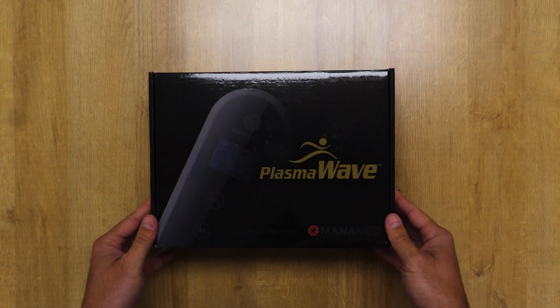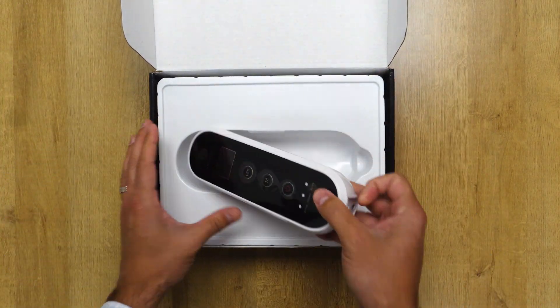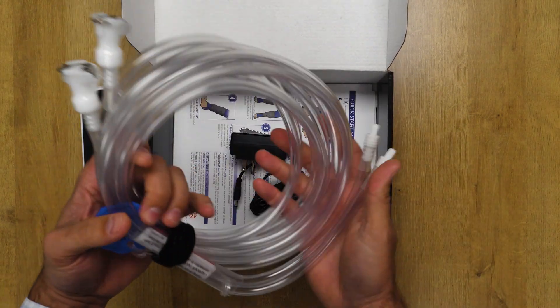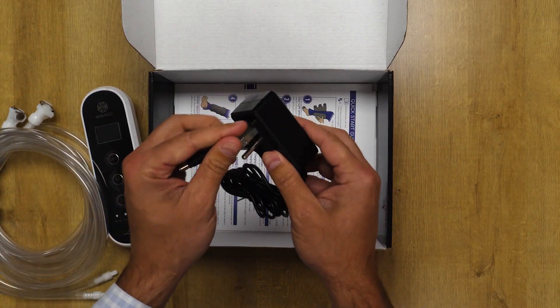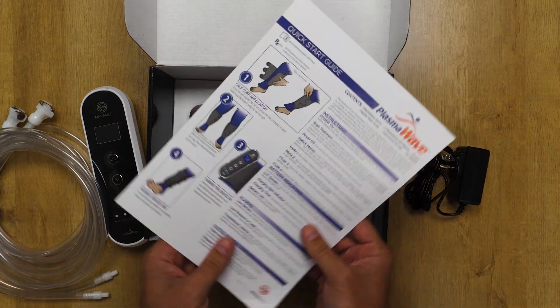This is the Monomed PlasmaWave hospital-grade SCD device. It comes with a unit, tubing for the SCD sleeves, and a grounded three-prong charger. It also includes the indications for use and the product manual.